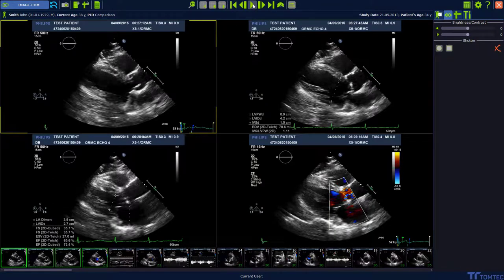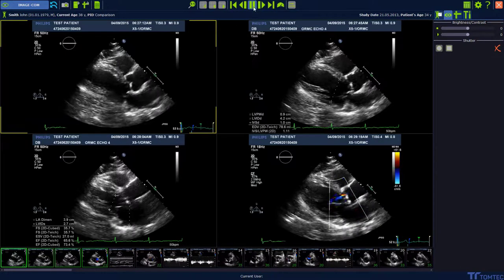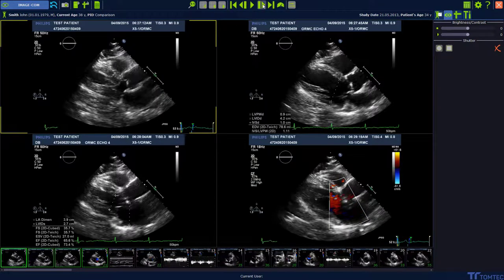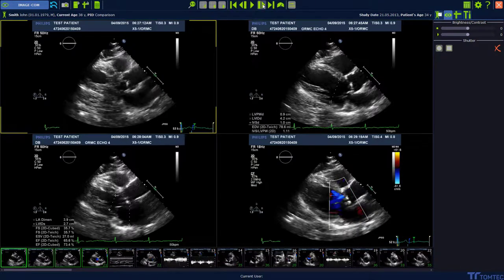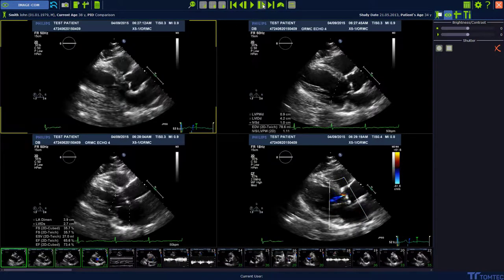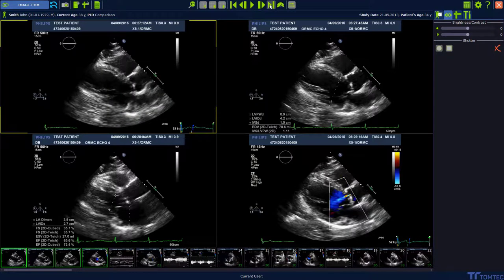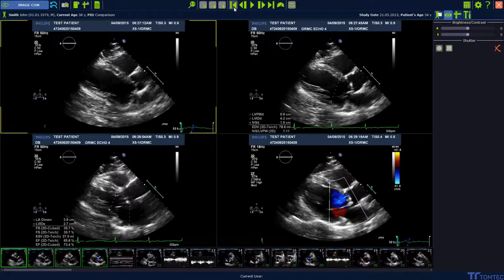In the middle of the toolbar we find the play or pause option, as well as next frame, last frame, or first frame.